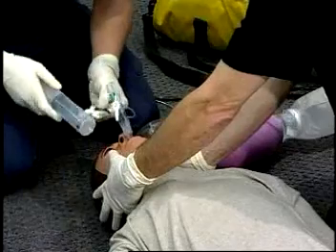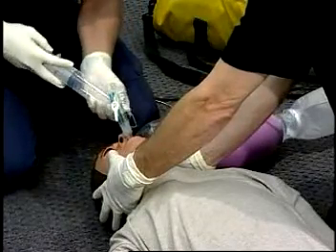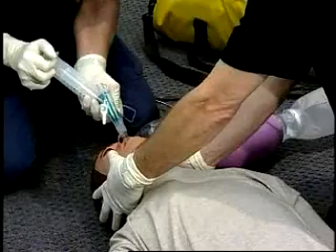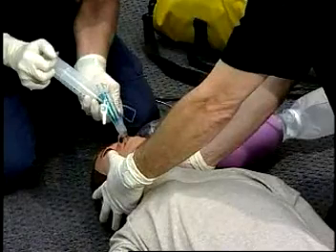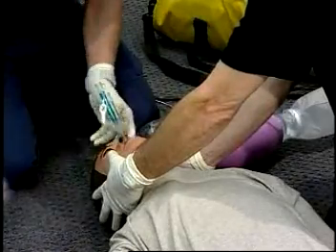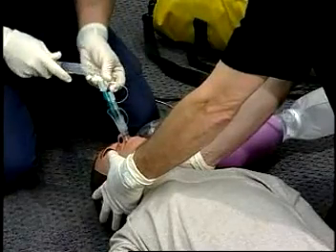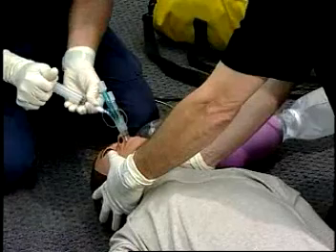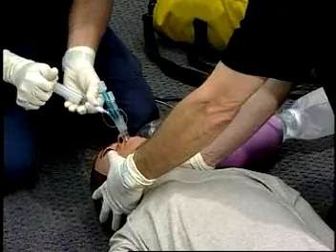Using the large syringe, inflate the pharyngeal cuff marked number 1 with 100 cc's of air. The device should now be seated in the posterior pharynx just behind the hard palate. Now use the small syringe to inflate the distal cuff marked number 2 with 10 to 15 cc's of air.